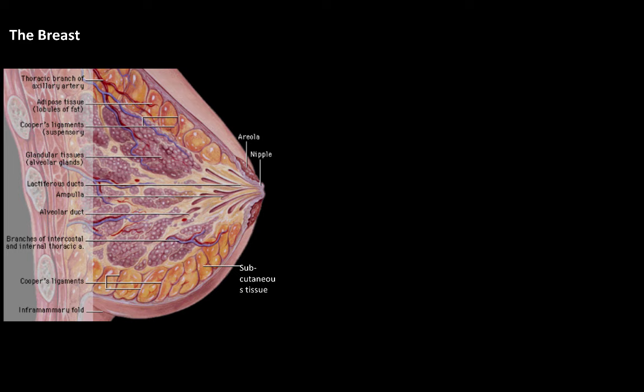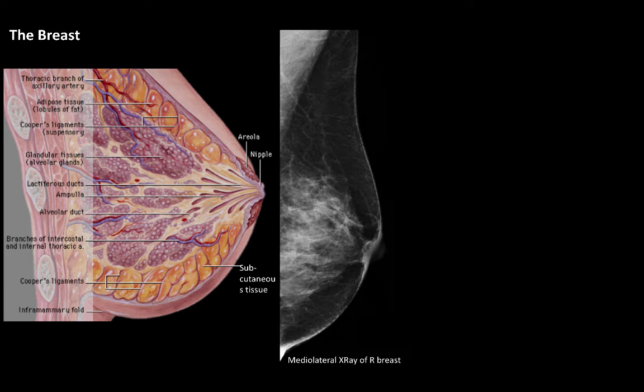Here is an image of the normal anatomy of the breast. On a medial lateral x-ray we can see the pectoralis major muscle and the Cooper's ligaments, also known as the suspensory ligaments of the breast, which are connective tissue septa extending from the clavipectoral fascia towards the skin.